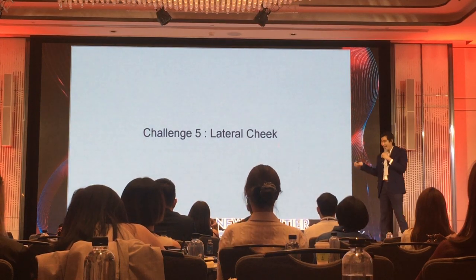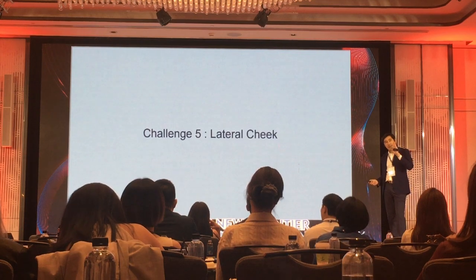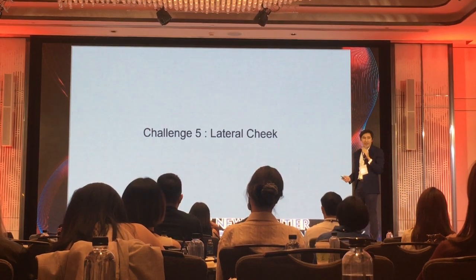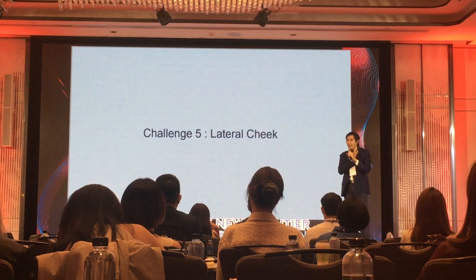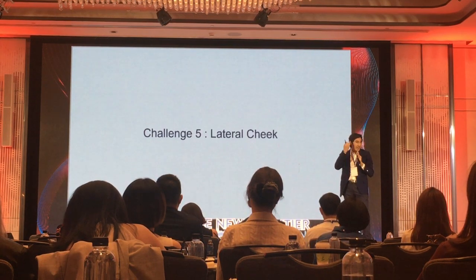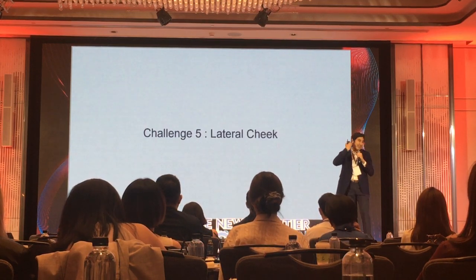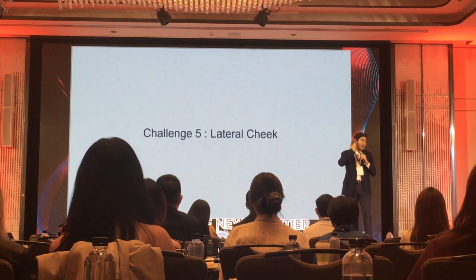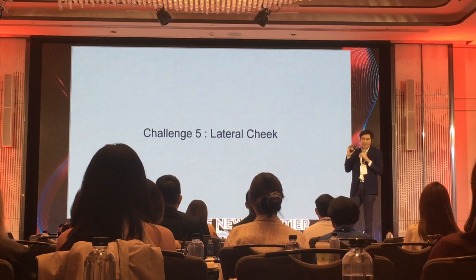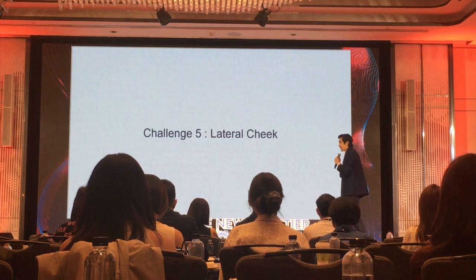The last one is my challenge number 5, the lateral cheek lifting. The problem is the subcutaneous plane right here is quite thin. In some cases, you may see the trajectory of the thread or the cannula, the line from outside, after you do the thread lifting. The patient can see the line of the thread outside, because of the thin skin, thin soft tissue, thin subcutaneous plane.